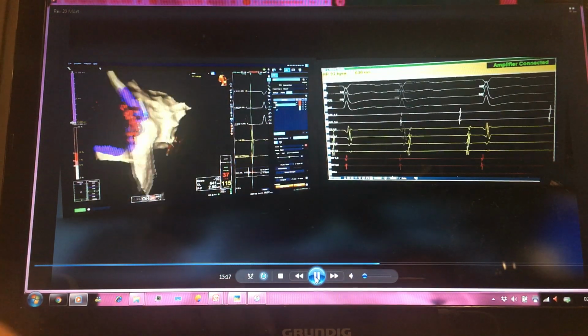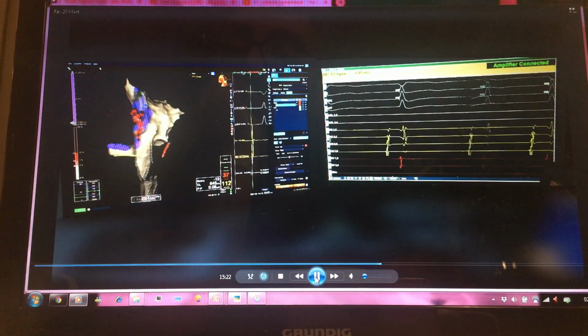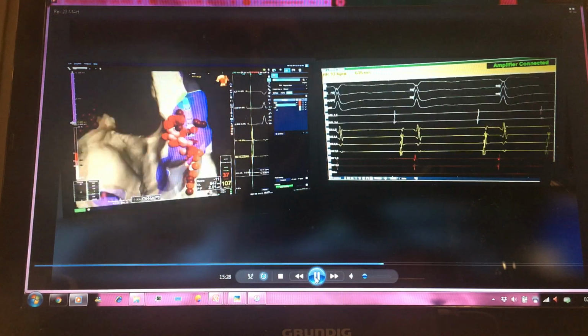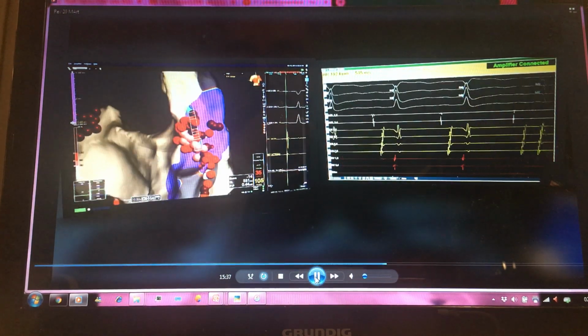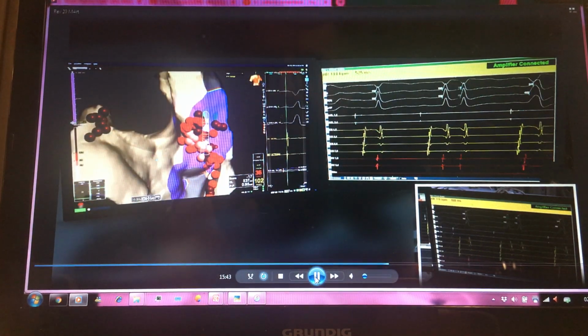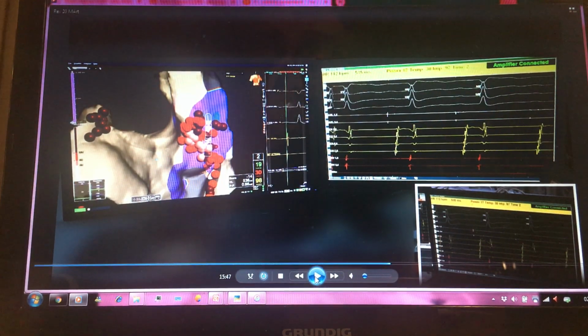in this case we checked the atropine response before the procedure, and after atropine administration heart rate increased to 115 BPM, so we try to achieve this target. Now we are just checking whether there is any significant scar tissue in superior vena cava, but this patient is very young, so we didn't think there was any significant scar tissue before ablation, but just try to demonstrate it.